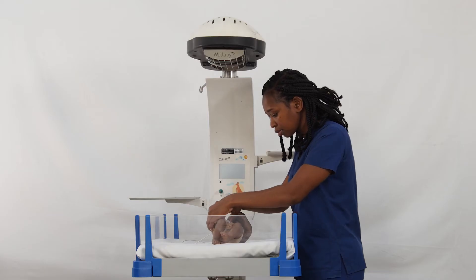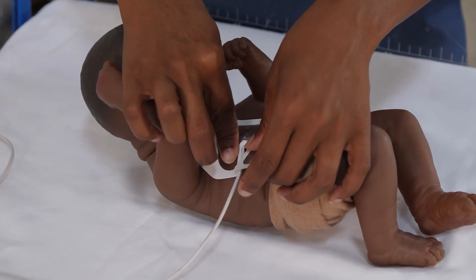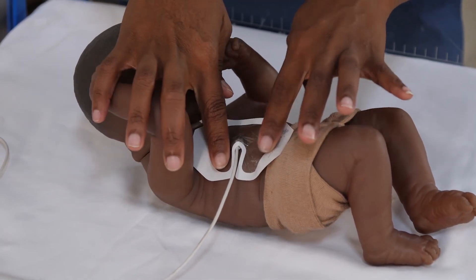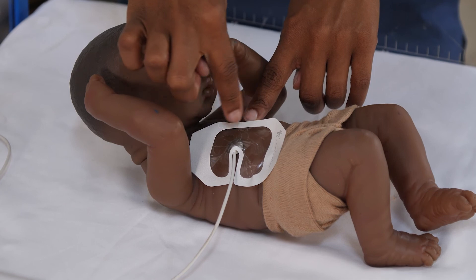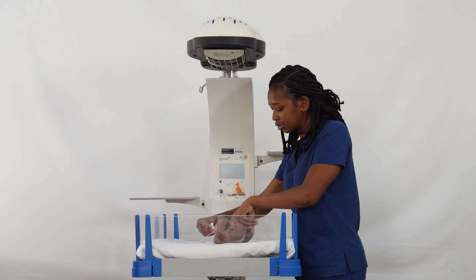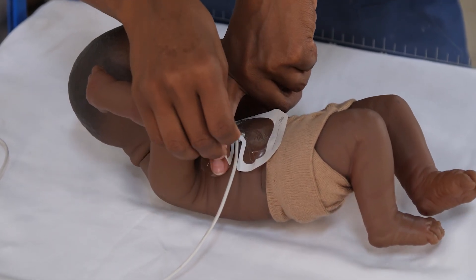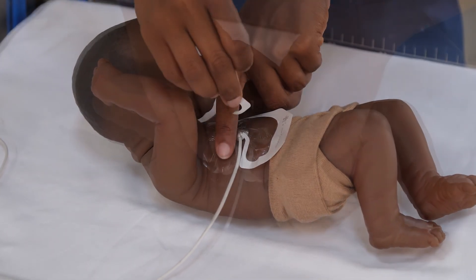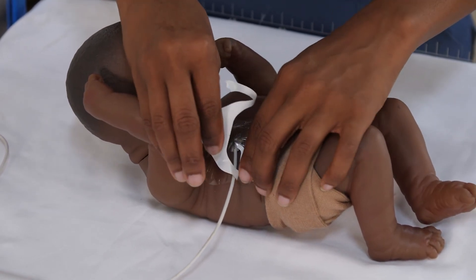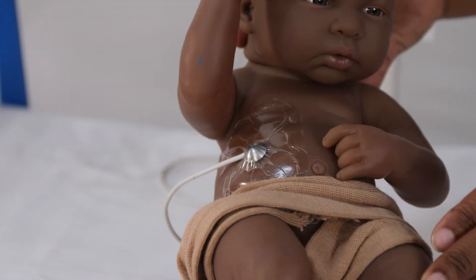You don't need to stretch it or press it down tightly — it is not a bandage. It is just to keep the probe against the skin while the baby is under the radiant warmer. Then remove the white paper gently so that you do not hurt the baby. This is how it's supposed to look.